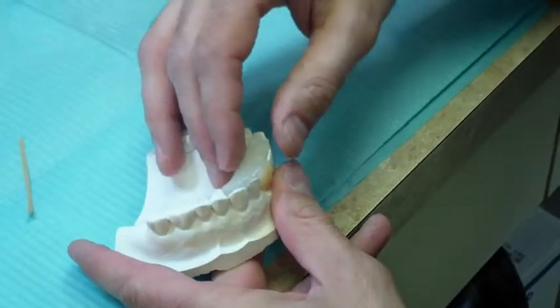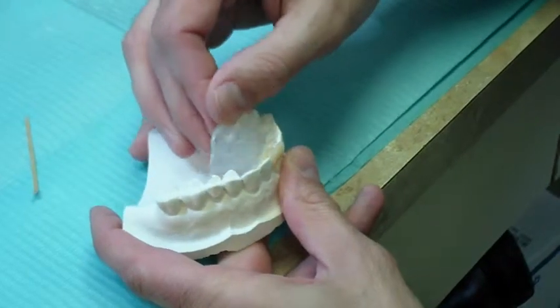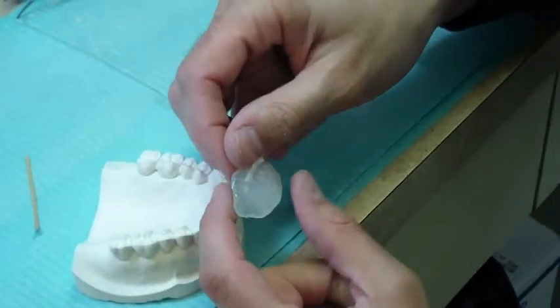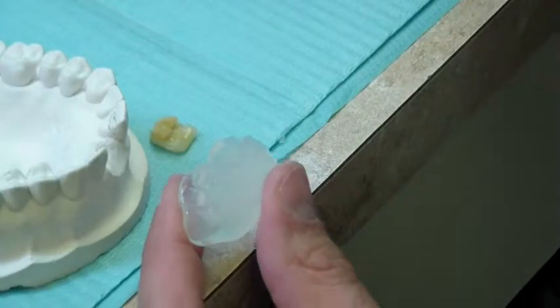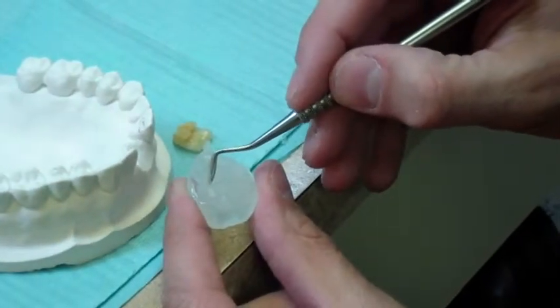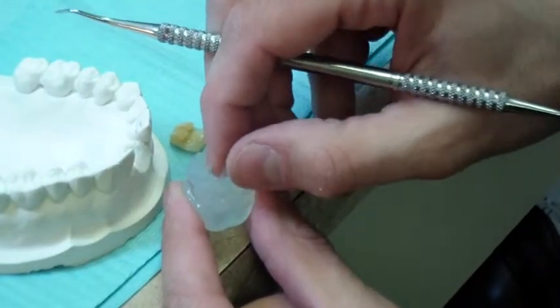Once the silicone is cured or set, remove the matrix from the model. Remove the spacer wax and set it aside in one piece. It will be used to measure the precise length of fiber ultimately used in the case.